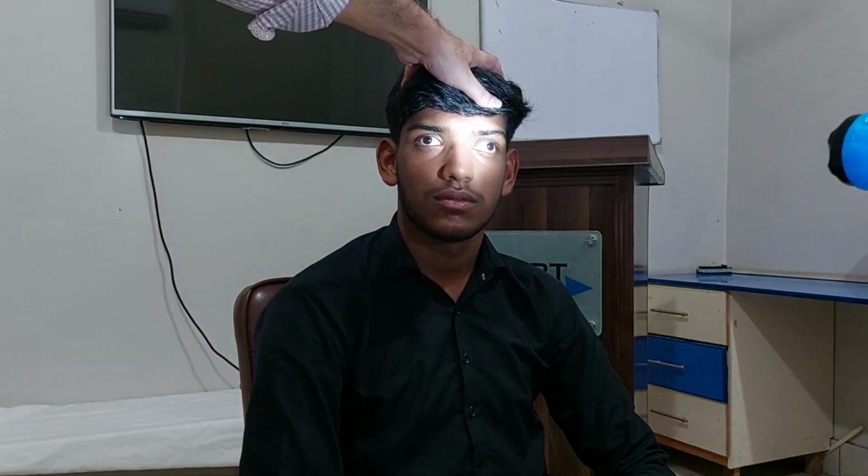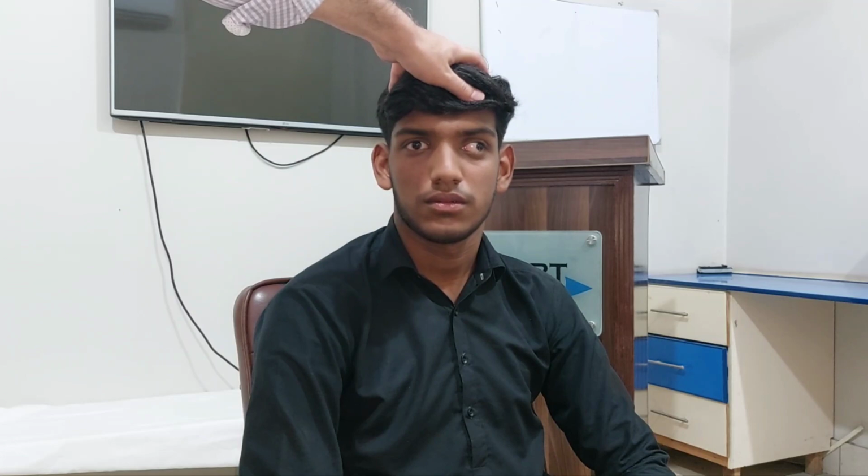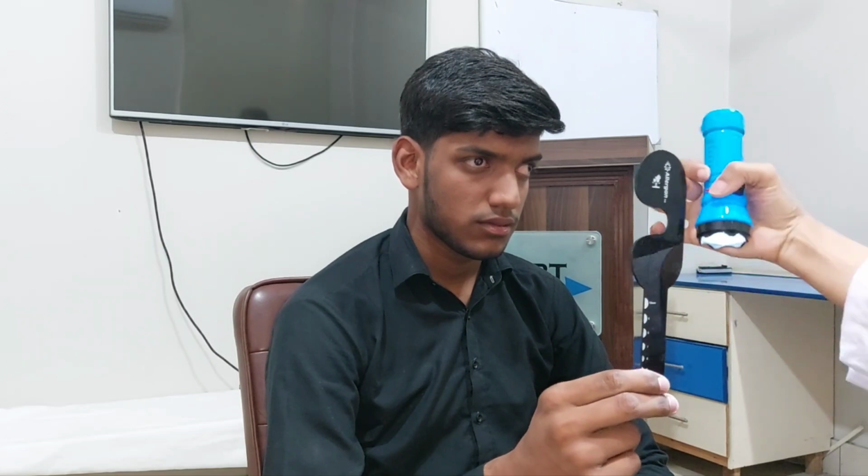Okay, let's have a look. Look at this light. Okay. So there is left divergent squint. So you have a rough assessment of the squint with the Hirschberg: how much is the squint? Is it divergent or convergent? So that you can start with the appropriate prism.